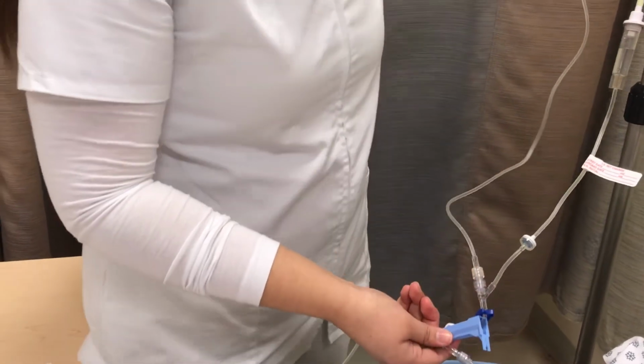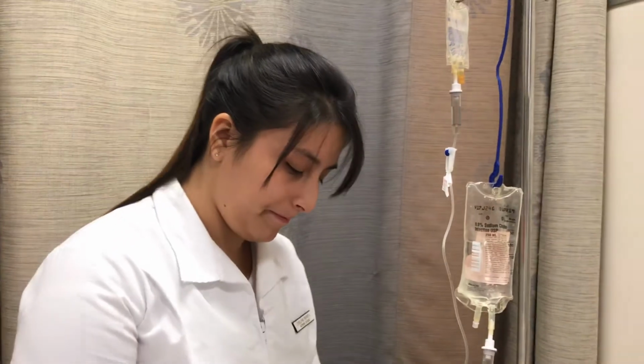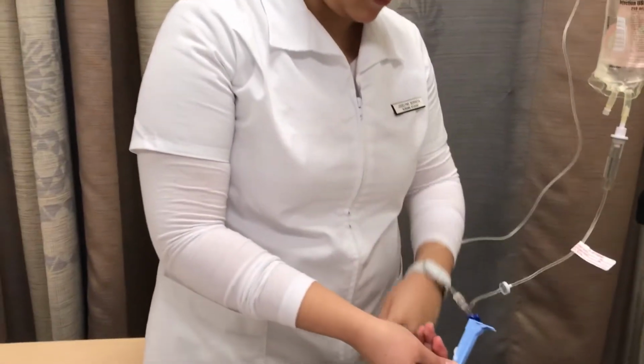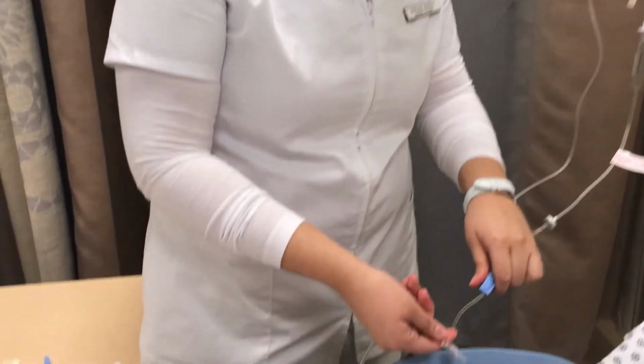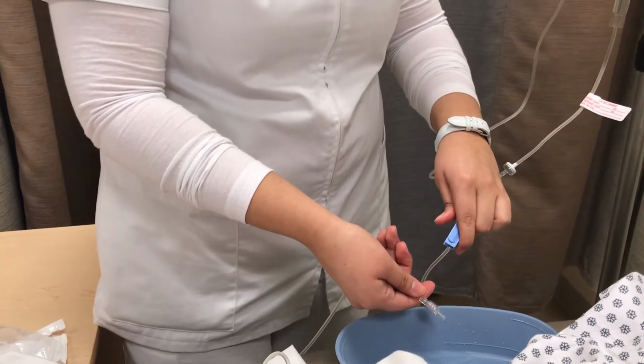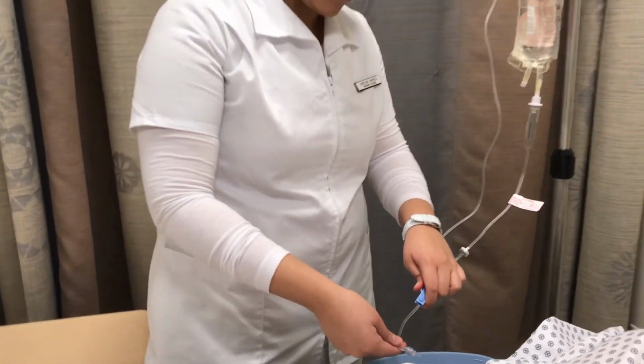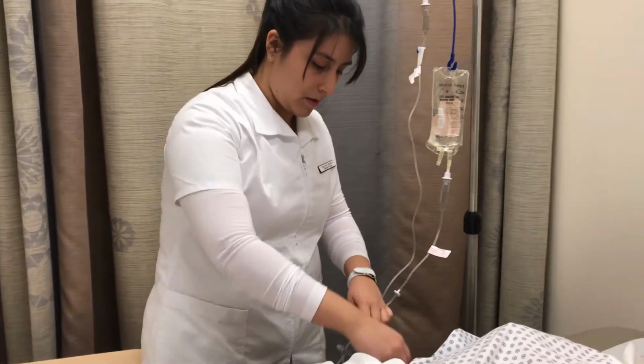Okay. Unclamp the piggyback completely. Making sure it is coming from the piggyback. Yep. Okay. So now this will be inserted into the patient's arm.